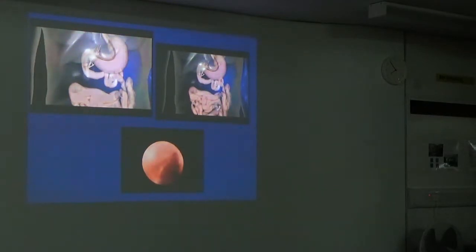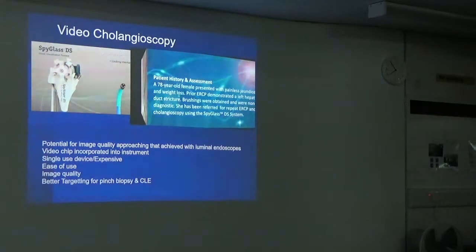Bottom image is just showing you a view, seems to have stopped working. Anyway, that's supposed to be a view down the instrument, and because it was a fibre optics instrument, the views weren't brilliant, but you could get views, you could get biopsies. But we have much better equipment now, so this is the current one that we use.